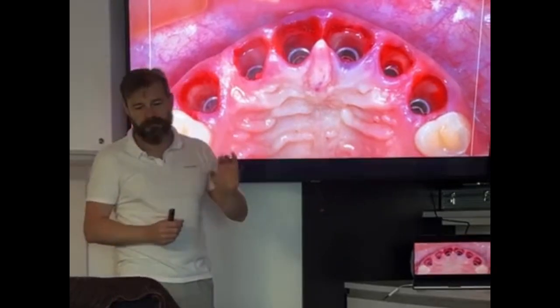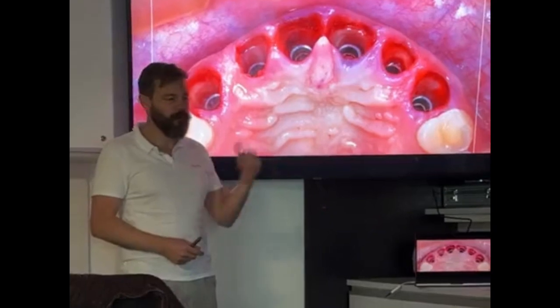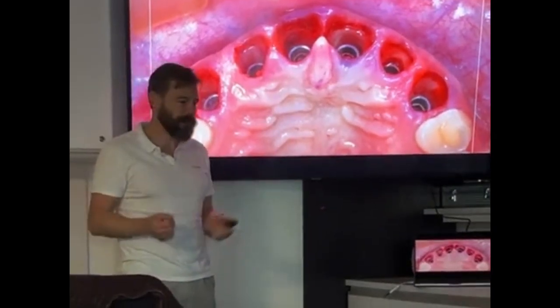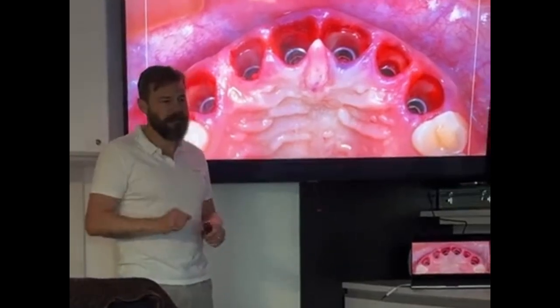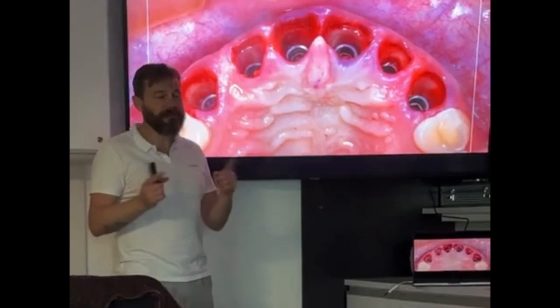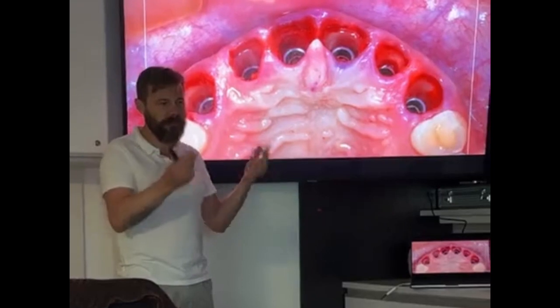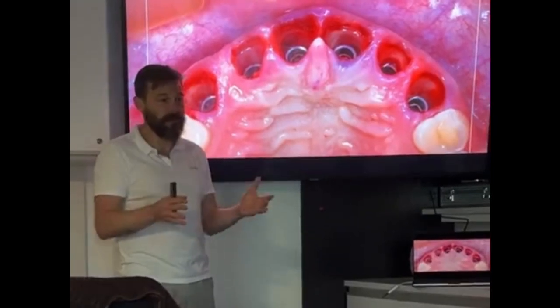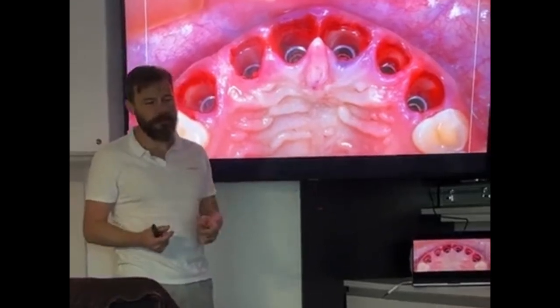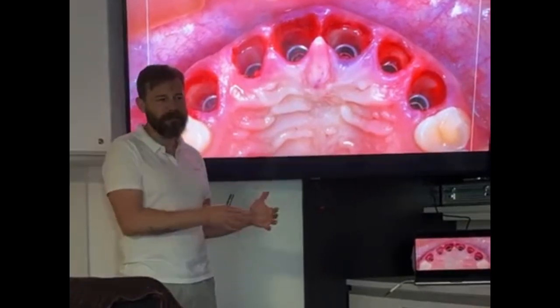You have many different kinds of bone regeneration technique. Quarry plates, bone blocks, sausage technique. I can use maybe titanium mesh, I can use Teflon meshes, or whatever. And not all these techniques completely isolate the bone from the soft tissue cells, right? For example, titanium mesh, full of holes, is not isolating the cells. Why does that work? Because it's mechanically stable, given the stability of the biomaterial.